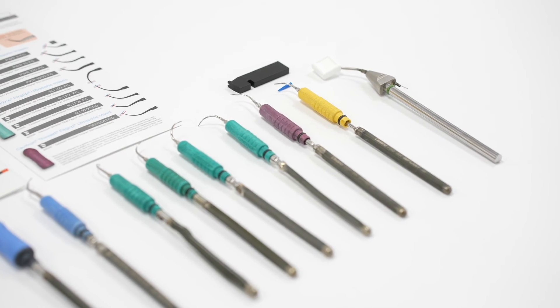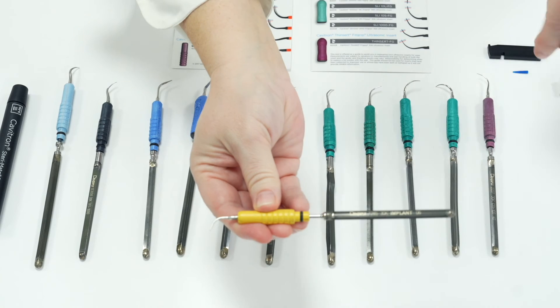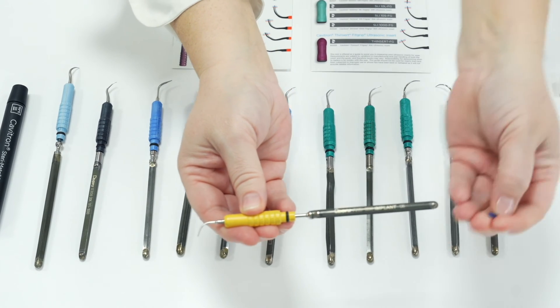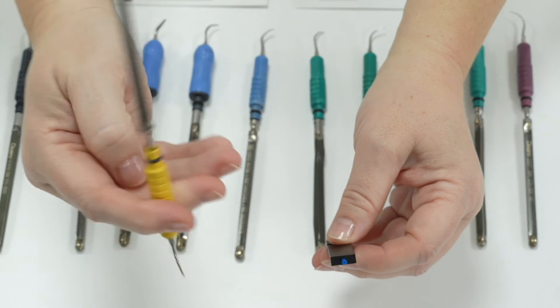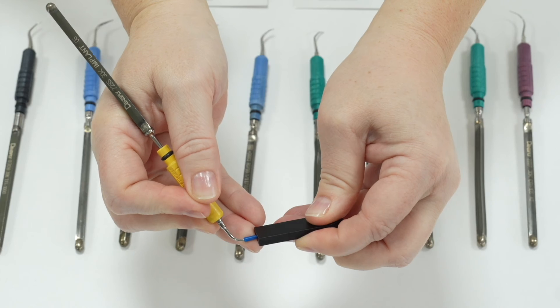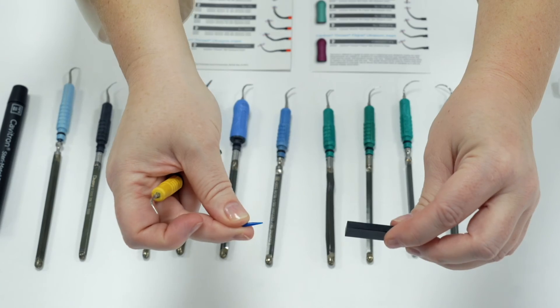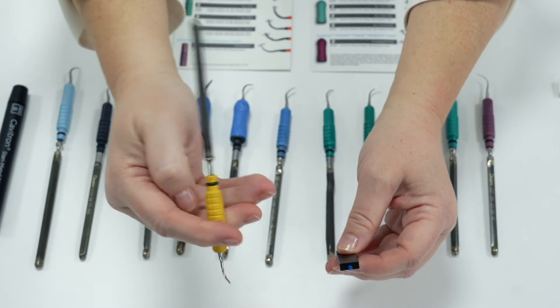The yellow implant insert has a detachable blue tip which can be secured and removed using the soft tip insert wrench. This insert is designed for cleaning around implants to protect the implant from being scratched. It is not designed to do any other scaling and should not be used without the blue tip. The blue tip should only ever be used with the yellow insert and never with any other insert.